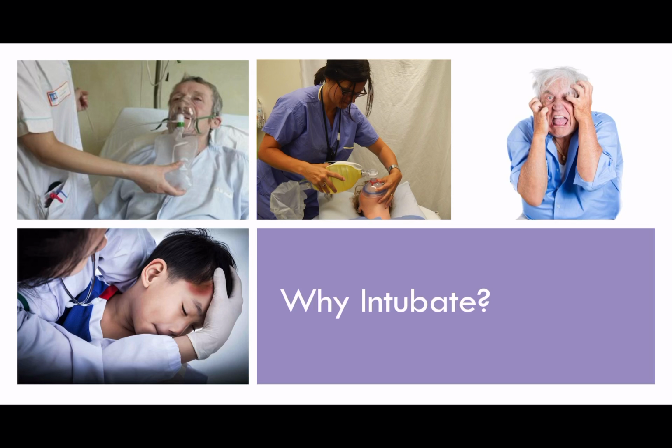In patients who are very agitated, sometimes we need to give them a level of sedation that may compromise their ability to protect their airway, but we need to sedate them for the protection of both themselves and for the staff. This is often a decision that is made by a very senior clinician because there are pros and cons to intubating a patient, and therefore it needs to be done in a careful and considered manner.